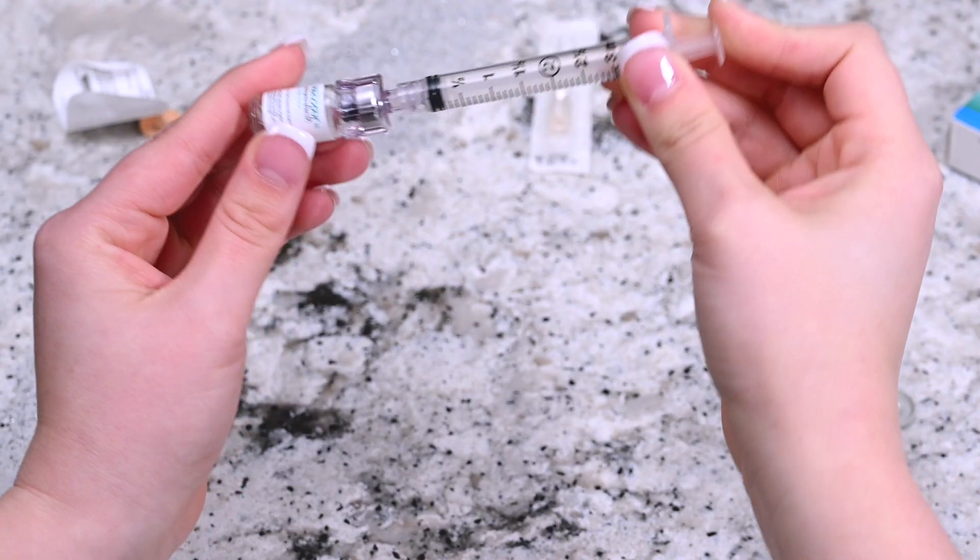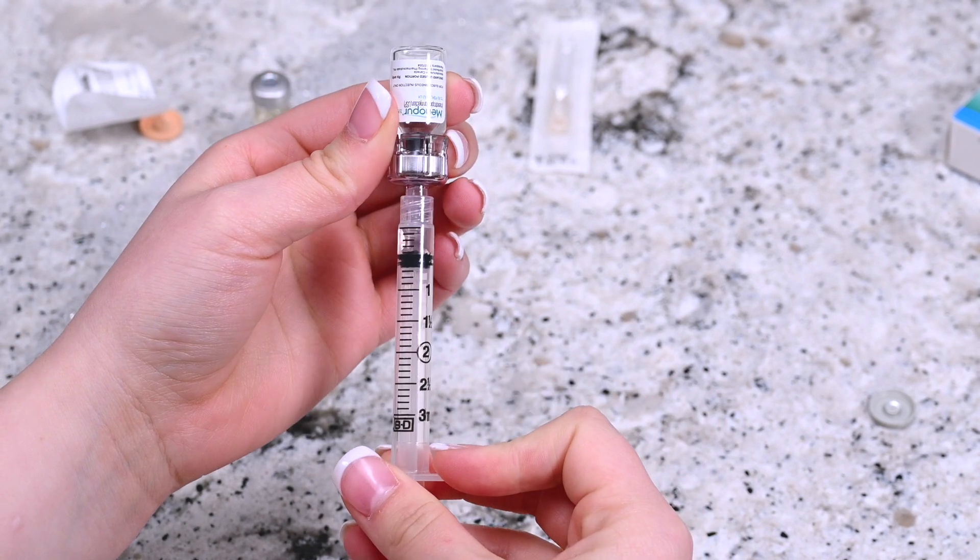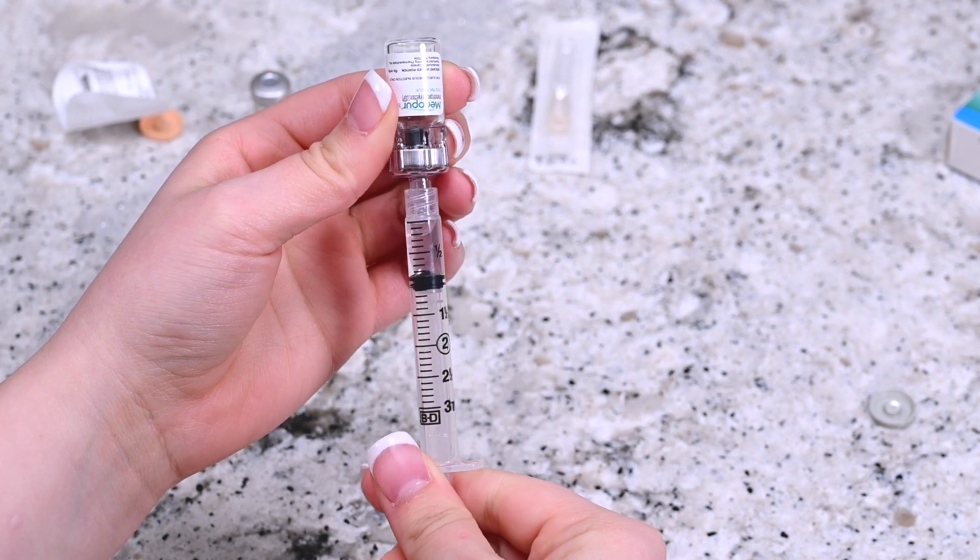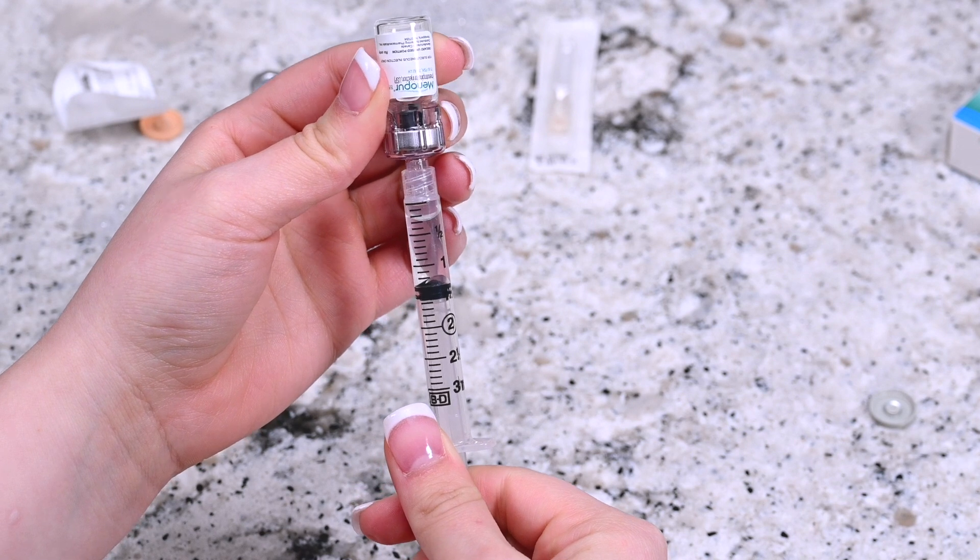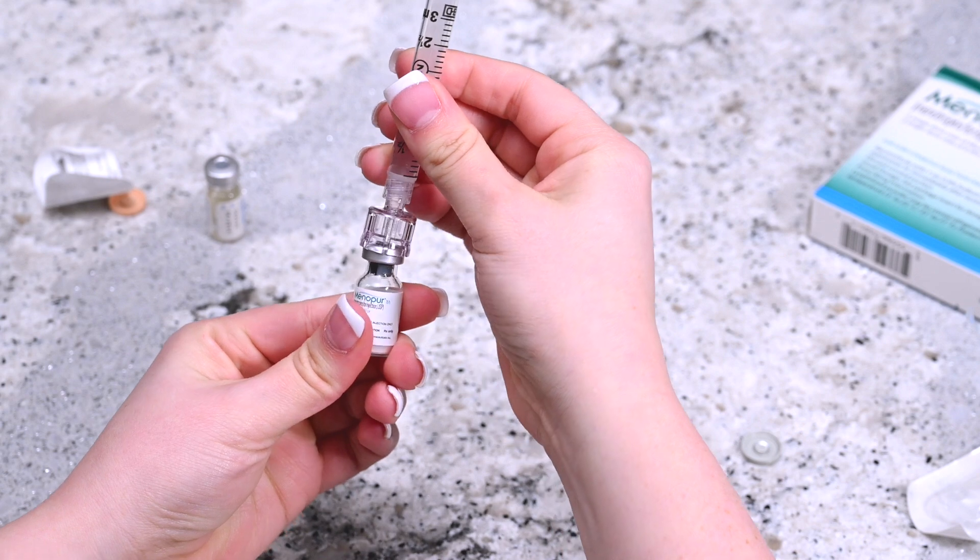Invert the syringe without removing it from the vial and pull the plunger back until all the contents from the vial transfer into the syringe. Remove the now empty vial from the q-cap by gently pulling the vial off the q-cap.